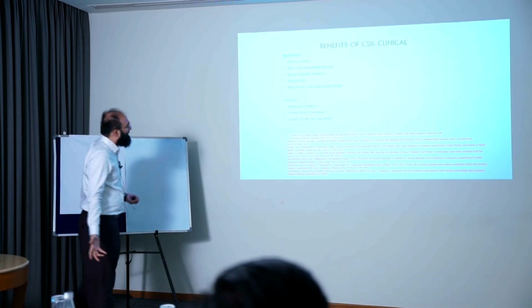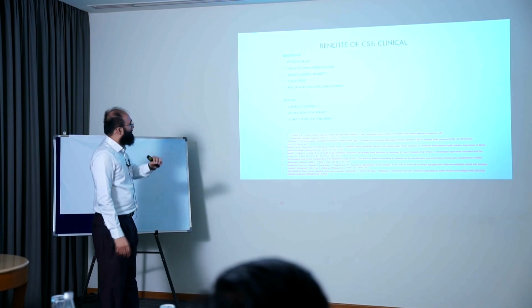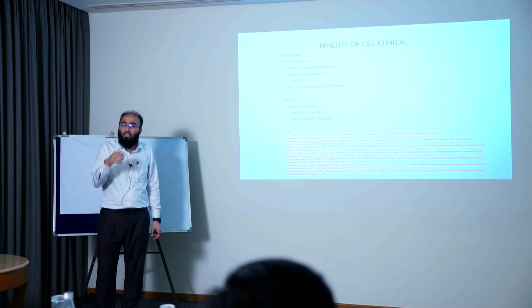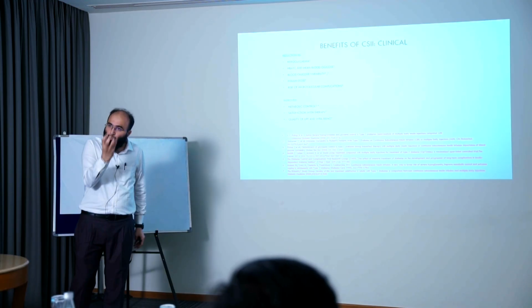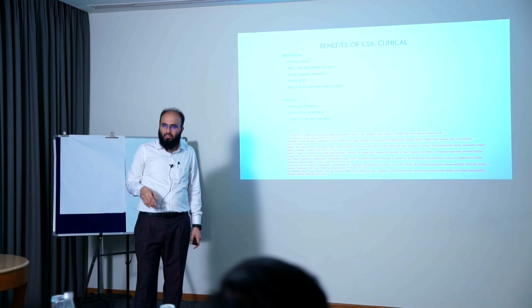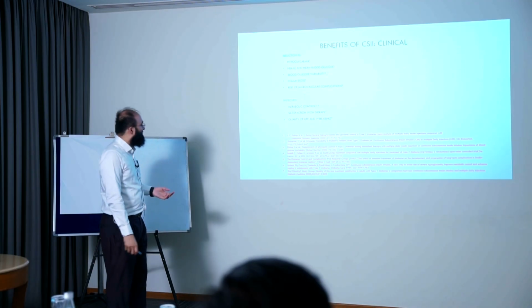So what are the benefits of CSII? The clinical benefits are a reduction in hypoglycemia, a reduction in HbA1c and mean average glucose, improved blood glucose variability, and reduced insulin dose. Because if a patient is on multiple doses, he may be taking more than usual, and in fact, with the risk of hypoglycemia, he might be doing defensive snacking as well. But here, with the precision with which the insulin is being delivered to the patient, the dose is reduced. I've seen a patient go from 120 units of insulin per day to 80 units with the pump. Risk of microvascular complications is reduced. There's improved metabolic control, satisfaction with therapy, and improved quality of life and well-being.